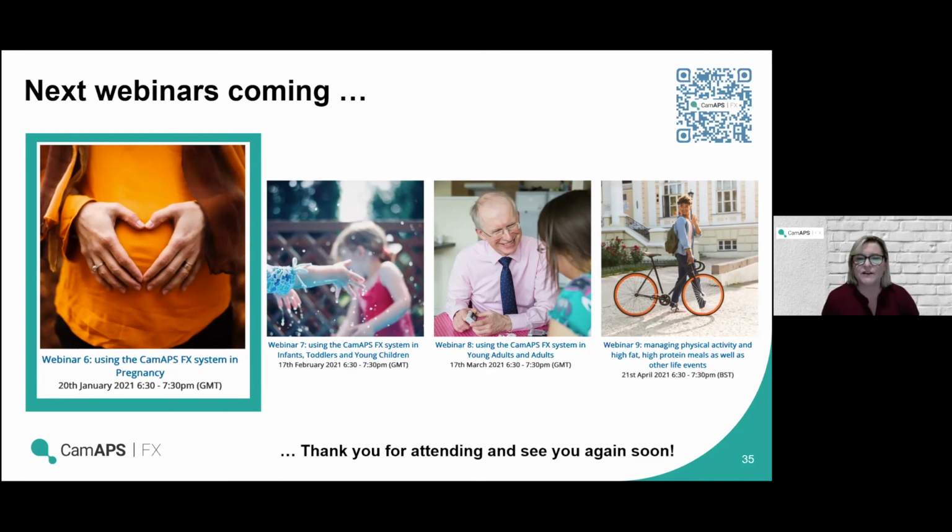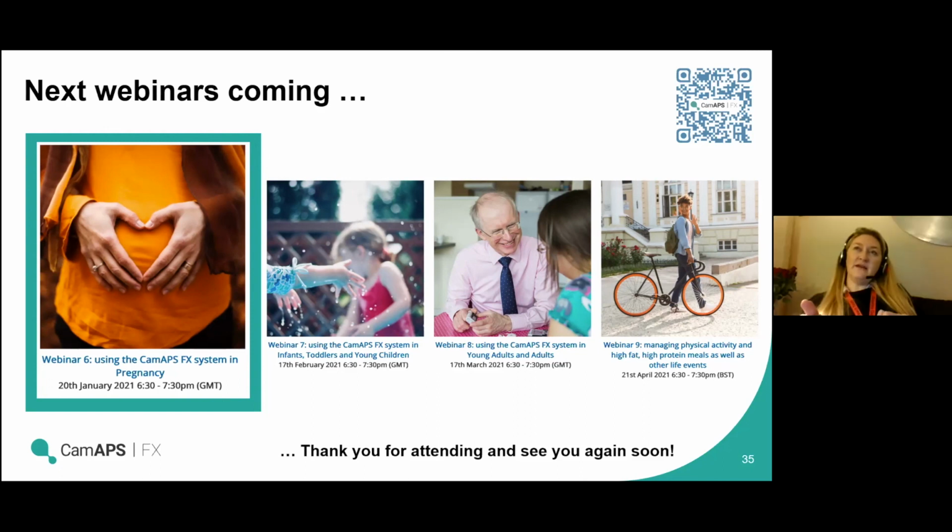Great, thank you. So is there any way of seeing the total insulin on board, including what the algorithm has given in the background? No, so if you press the little I in the top right, you see the insulin that is currently active from the boluses. And if you look in the stats for the day, you can see what insulin's been delivered in the day, but it won't spit out what's active from the system's basal compared to what's gone in from the bolus. The only way you can do that is by totting it up. It doesn't spit it out.